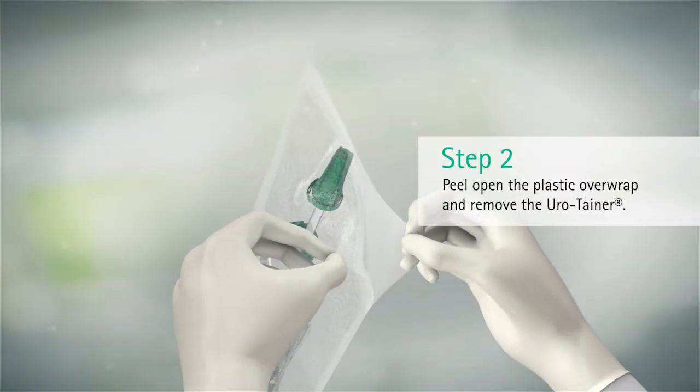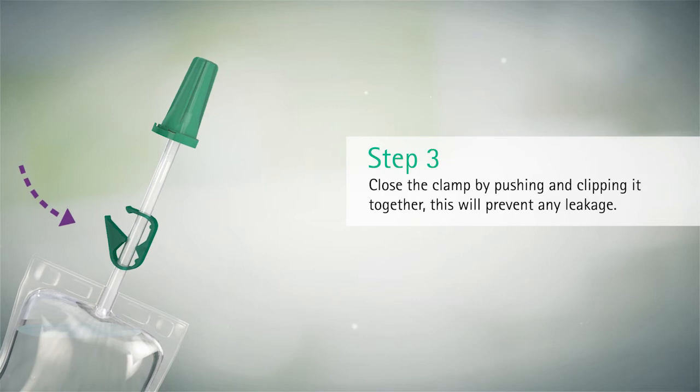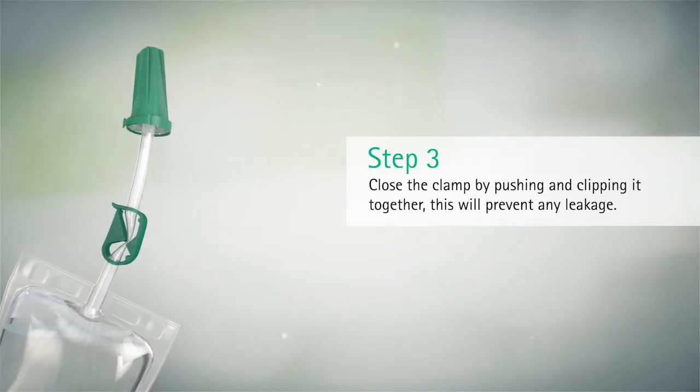Peel open the plastic overwrap and remove the Eurotainer. Close the clamp by pushing and clipping it together. This will prevent any leakage.